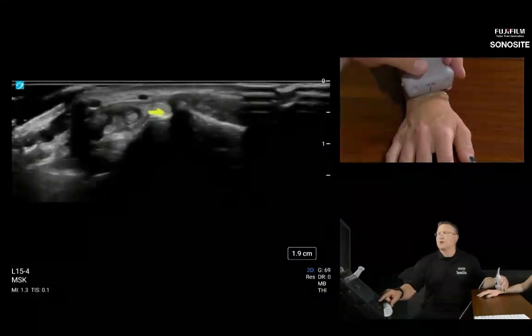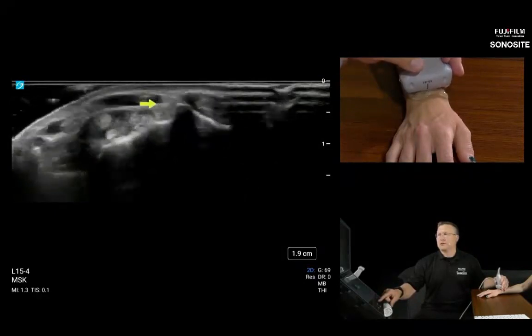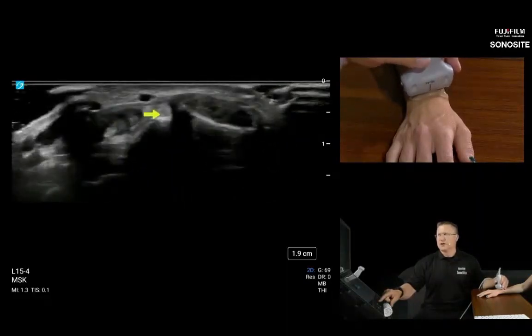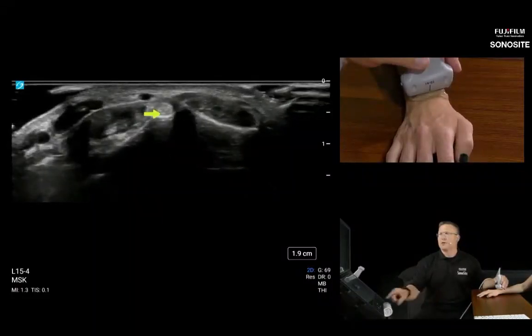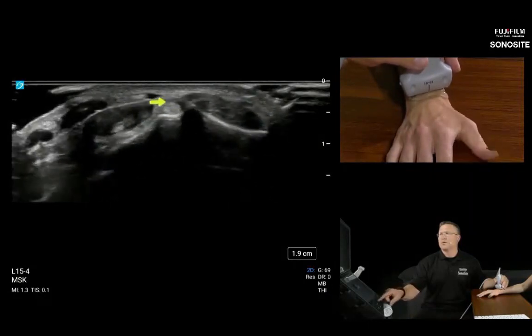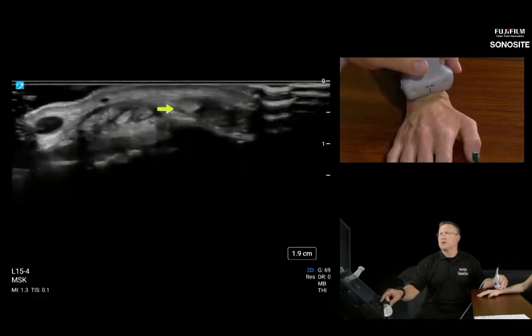And then here we are at compartment number 3. We see this oval. It's kind of standalone. It's always underneath one of these little superficial veins, probably a branch of the cephalic. And to just check our work, I'm going to have our model twitch her thumb, and that's going to activate this third compartment. So let's do a flexion, extension of the thumb. There we go. And we can see this tendon rolling. So that's the EPL in compartment 3.